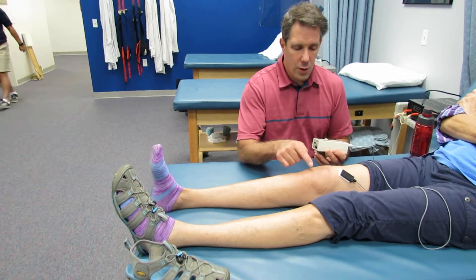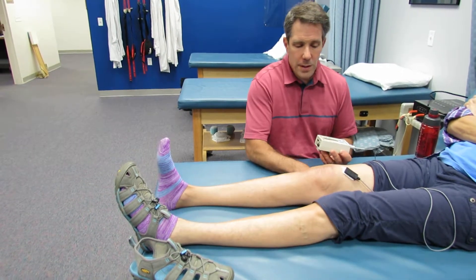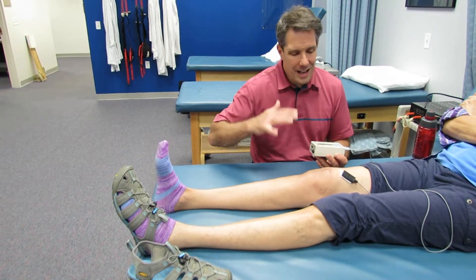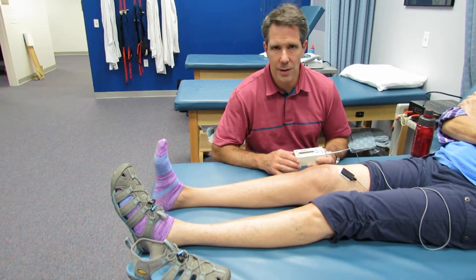The other thing we look at is for the patella to be migrating superiorly — that's very important. So we're going to do this with some support, but then we're going to take the hand out and have her push into full extension. Once she can get a good strong quad, she's going to maintain her extension way better than just doing it passively all the time.